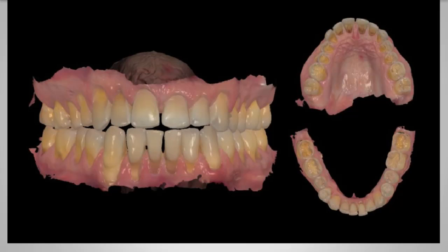In this patient's case, they came into my office about 6 months to a year ago, and they said, "Doctor, I've never had a cavity in my life." And looking around their mouth, I said, that's a true statement. I don't see any restorations at hand. Now, if you look closely at the screen, you'll see a tremendous amount of erosion that's present. They were never told they have any problems, but on both facial surfaces and palatal and lingual surfaces, we see a tremendous amount of erosion.